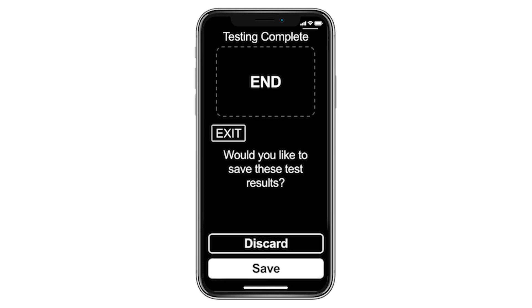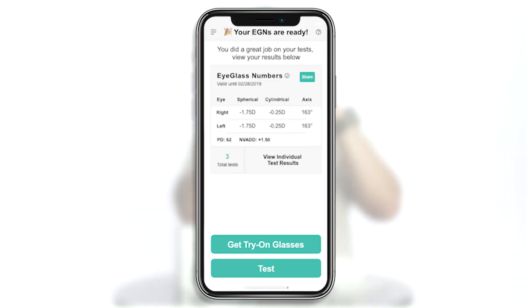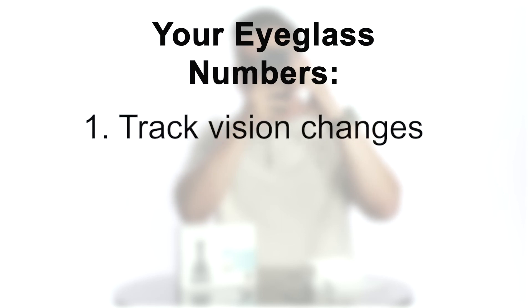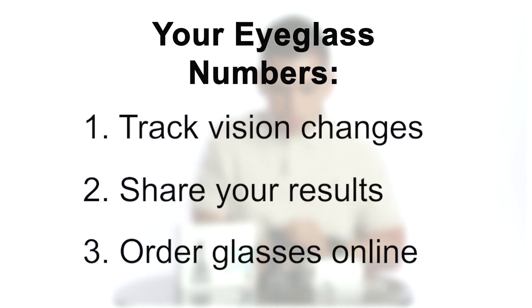Once both eyes are tested, you can choose to save or discard your test results. After you've taken three full tests, your personal vision tracker will generate your first set of eyeglass numbers. With your eyeglass numbers, you can track your vision over time, share your results with an eye care professional, and order glasses online.